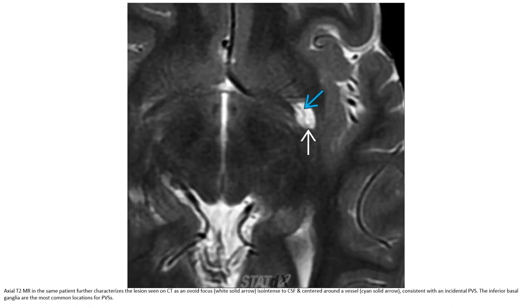This is the T2 image in the same patient. The lesion seen on CT appears as an oval focus of CSF-isointense T2 signal in the central basal ganglia, consistent with an incidental perivascular space. The inferior basal ganglia are the most common location of PVS.